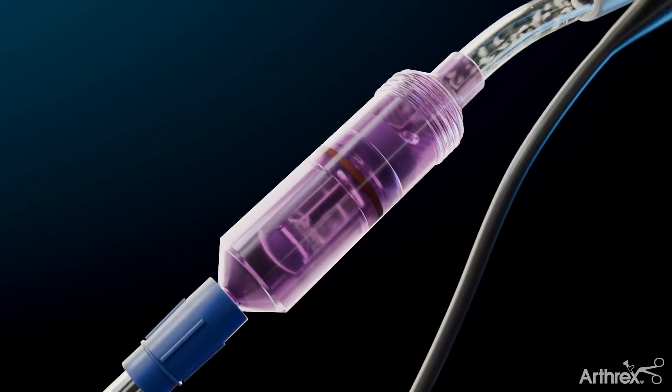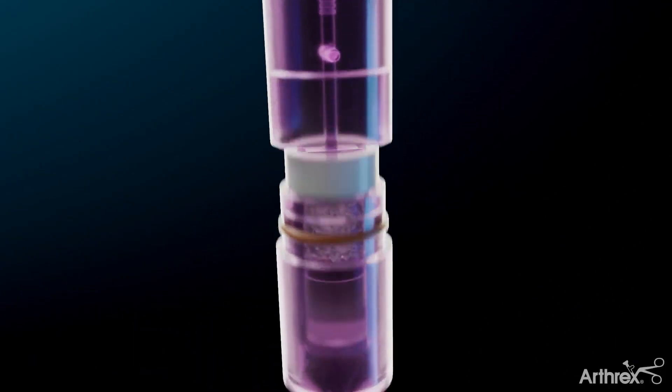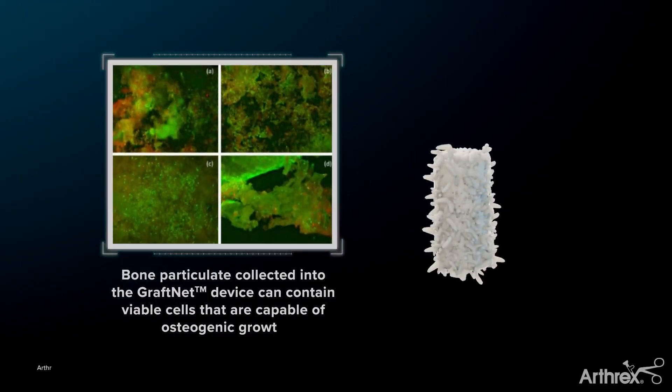The autologous bone debris will be collected in the GrafNet's sterile chamber. This autologous tissue is highly viable, demonstrating significant osteogenic capacity.